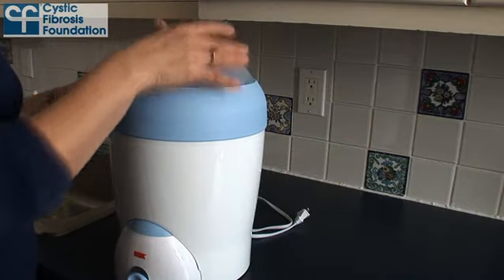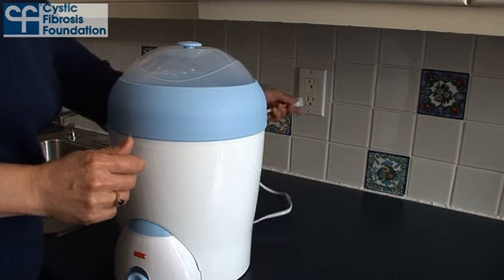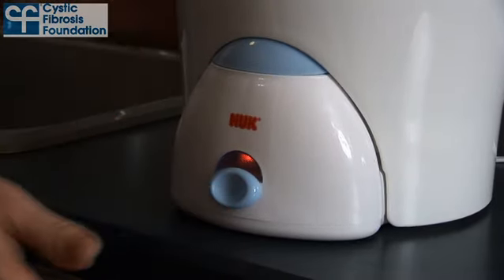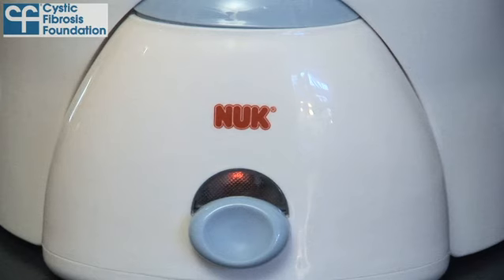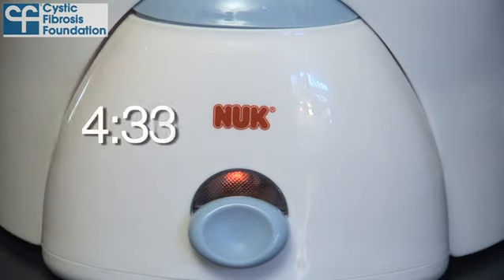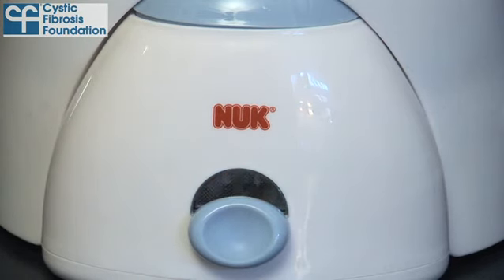Then place the lid on top of the basket and insert the power plug into a socket. Switch the device on using the on switch and the control light will light up. If the control light is already lit, this means the on switch has already been inadvertently activated. The disinfection process lasts about 8 minutes, and when it's done, the steam sterilizer will switch off automatically and the control light will go out.